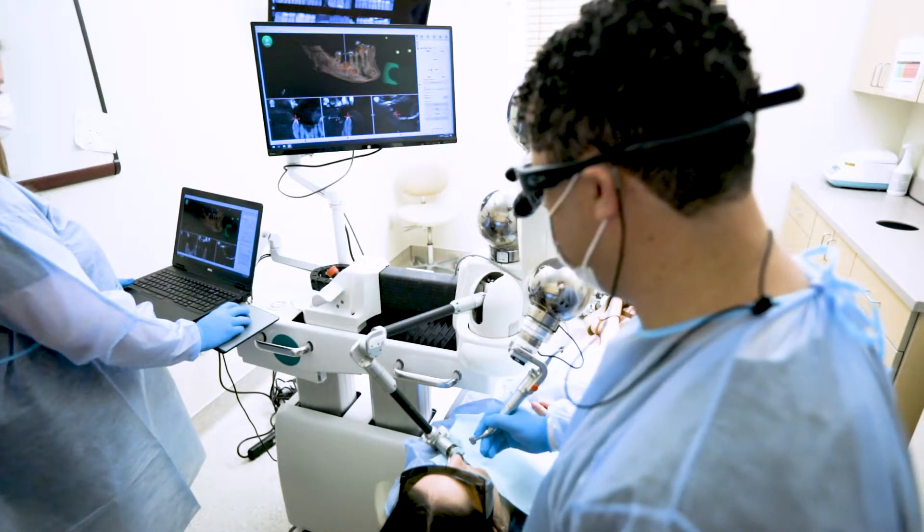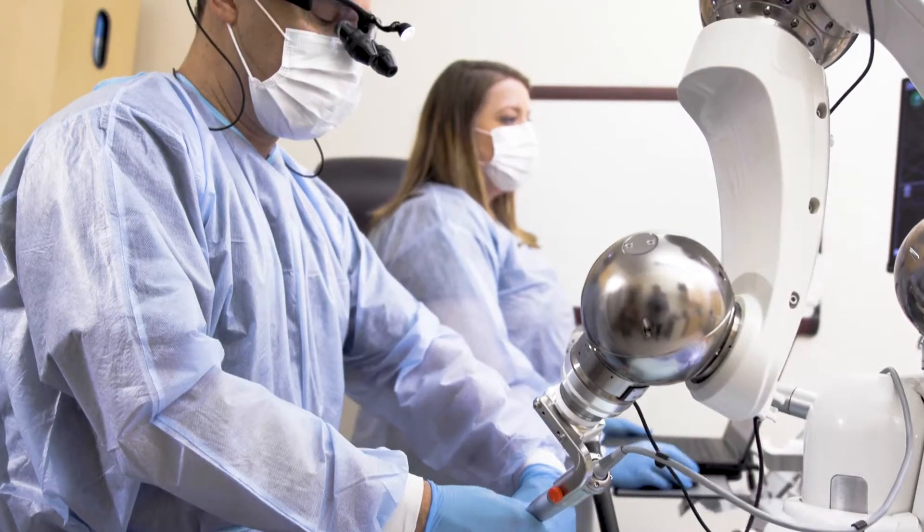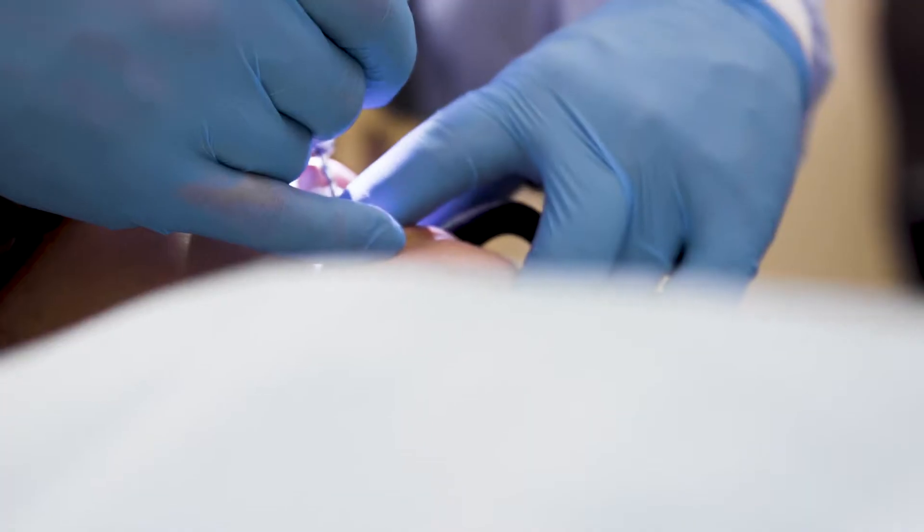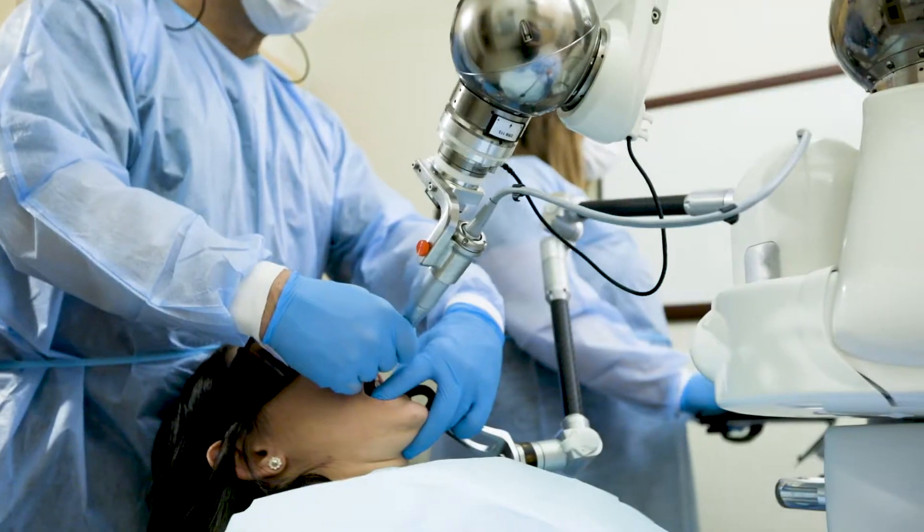You can also see the haptic guidance of the handpiece. As I move it in one direction, it gives me constant feedback as to where I am in relation to that virtual plan.